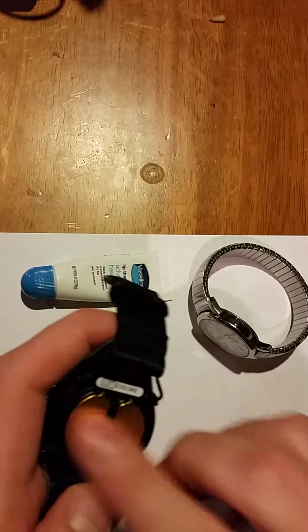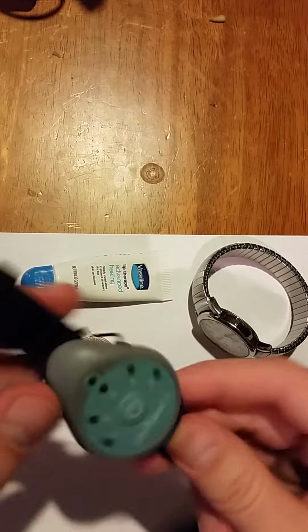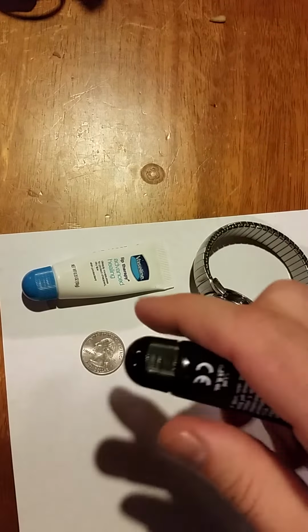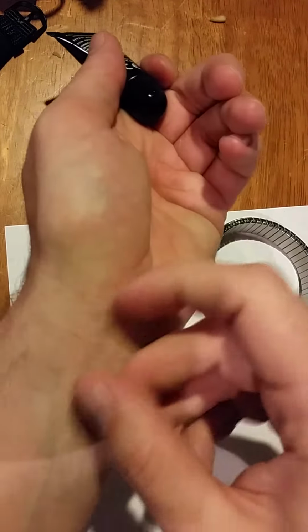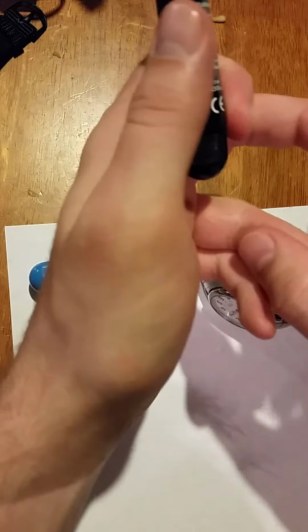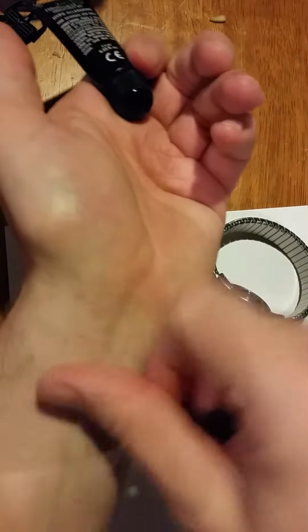So these are gold plated here for perfect conductivity. Before you pop it on, it comes with a tube of electrical conductive gel, which is basically a standard gel with salt in it. So you can actually make your own. If you ever run out in an emergency, you can spit here. Take some table salt, rub it on, and that will be conductive for a while until it dries out. You can take hand sanitizer, put some salt on it, and that can be backup as well.